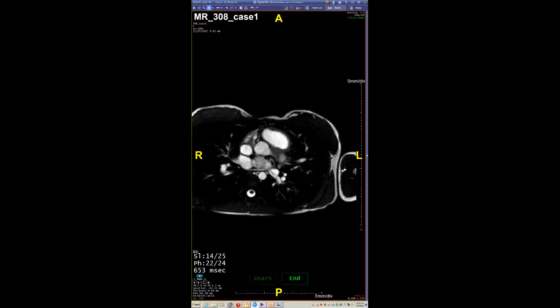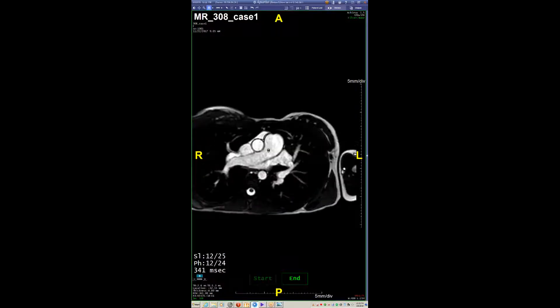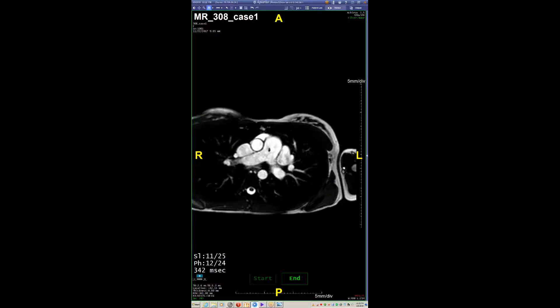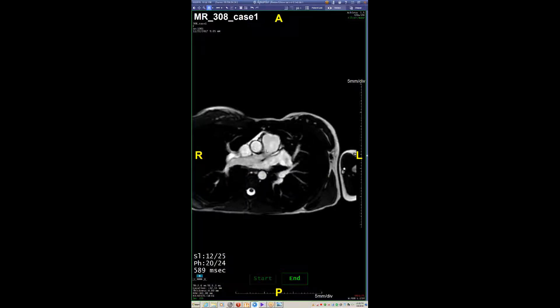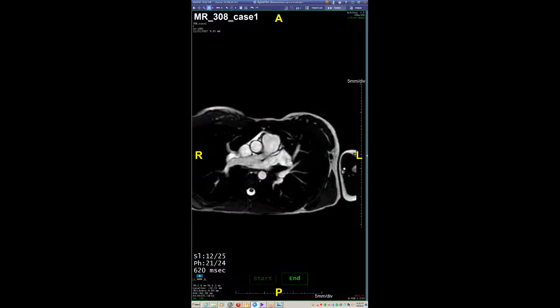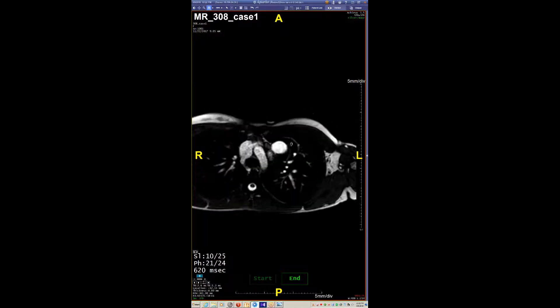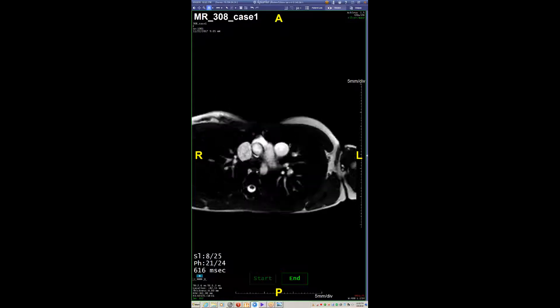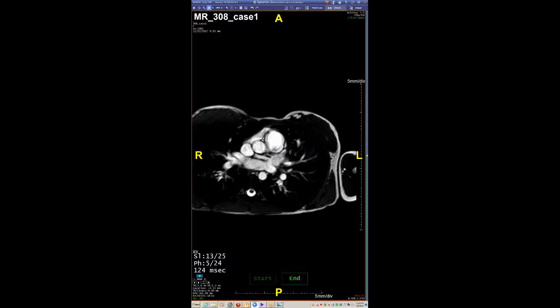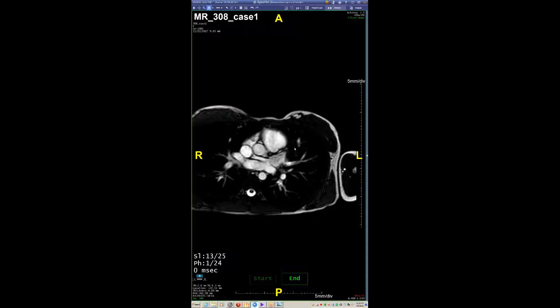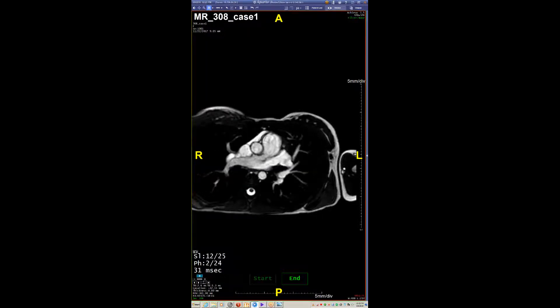It looks like the left lung drains into that vein — yes, there is pulmonary venous drainage into that. I was going to call it a persistent cardinal vein — I think it's a levoatrial cardinal vein. They've been calling it PAPVR, but it's really not. It just persisted because of the pressure in her left atrium, because of the cor triatriatum significantly obstructing — it just stayed persistent. She was a runner and could run marathons, then all of a sudden she could only run four miles. Presumably due to this, the blood flow going up and around via the arrows showing it going up and up, bypassing the systemic circulation.